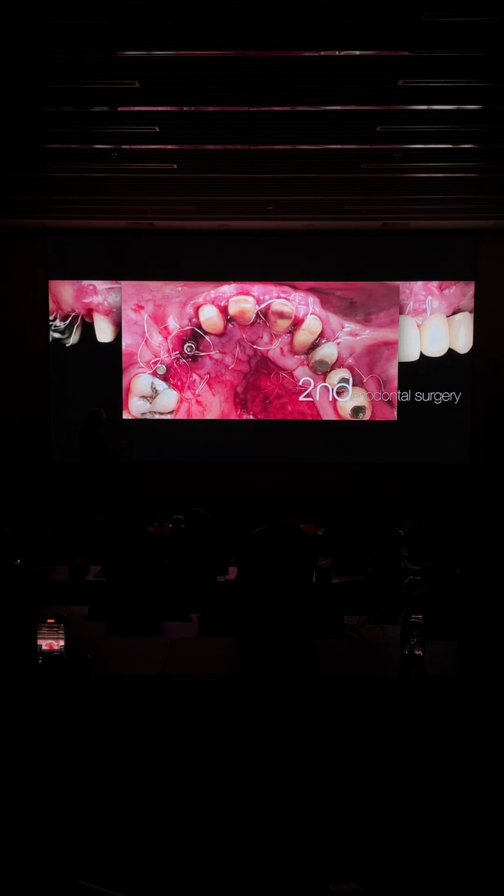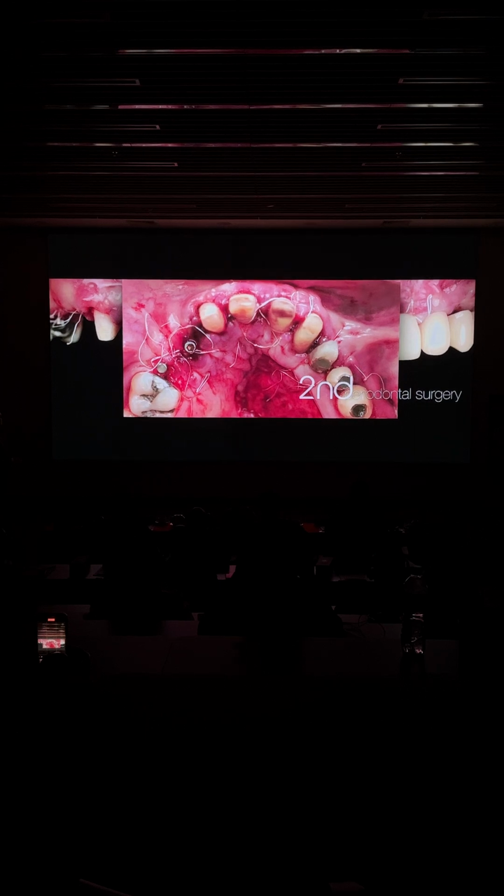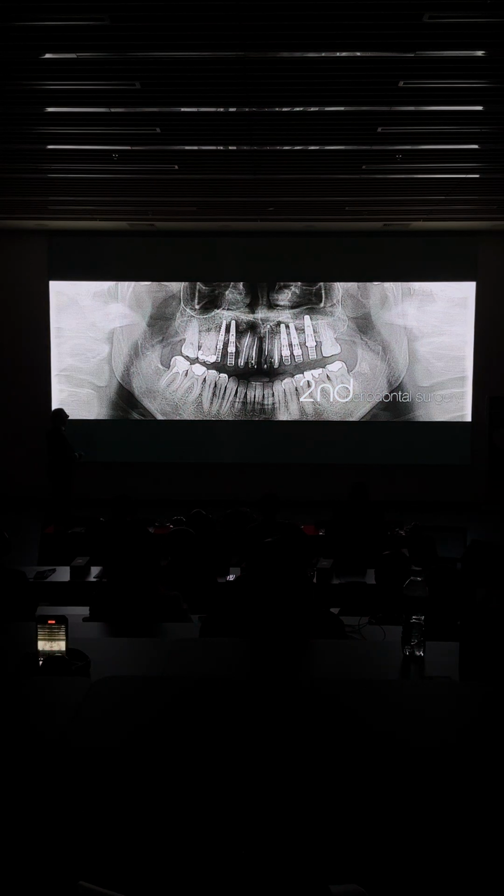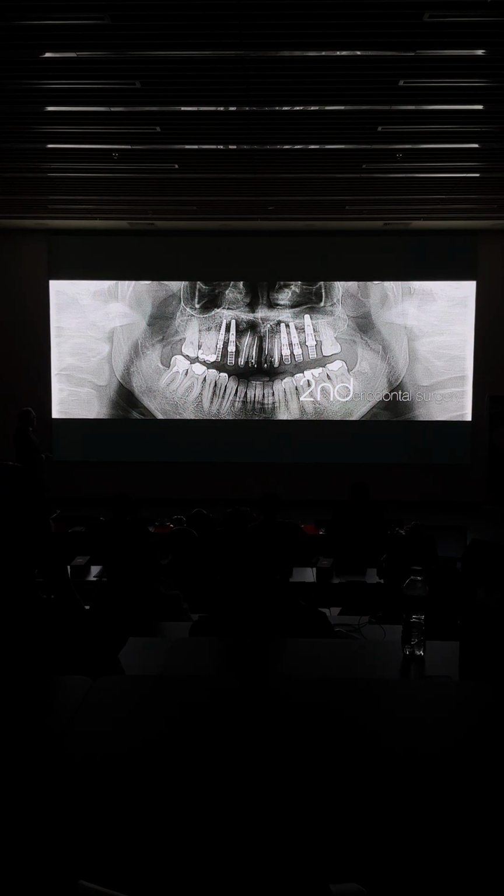So you can see that my hand doesn't tremble, and I take as big of a piece as possible to really overcome all the tissue that is necessary and plug all that tissue vertically and horizontally.